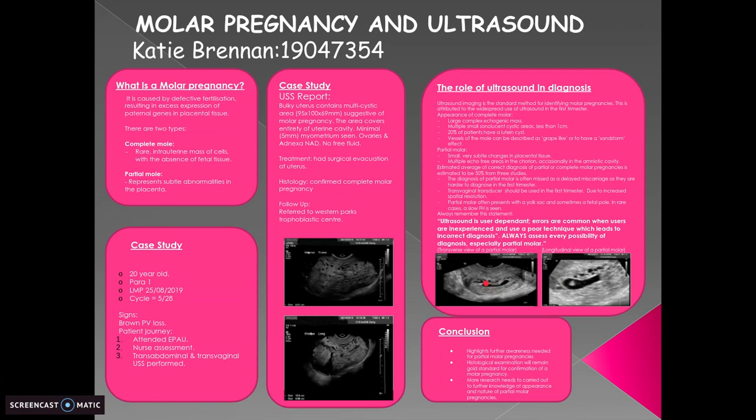In the uterine cavity are multiple echo-free areas. The appearance of this particular image quite clearly shows the echo-free areas which indicate partial mole.